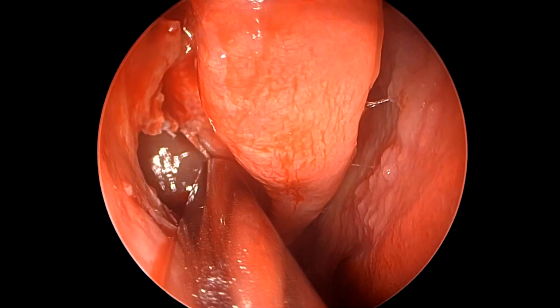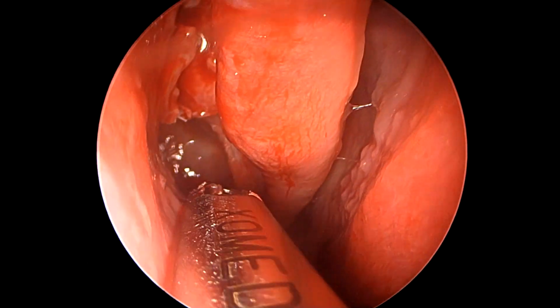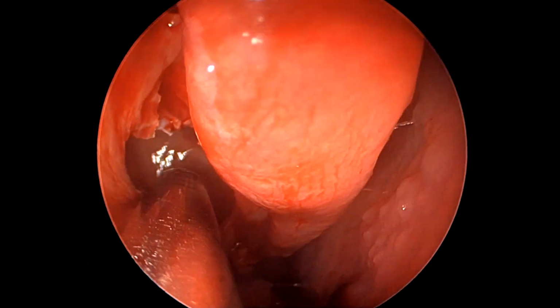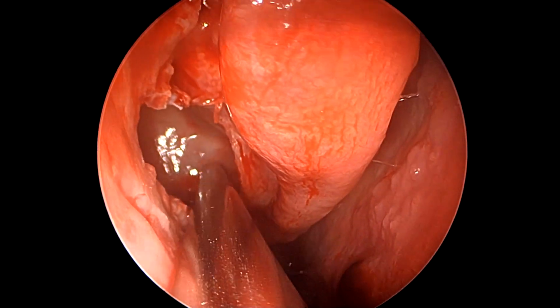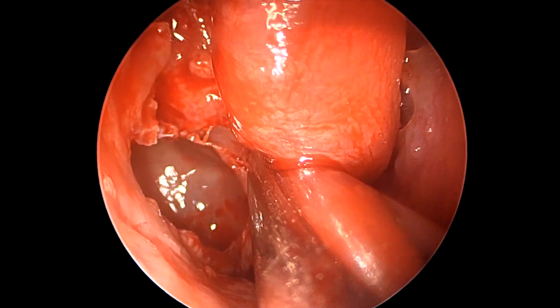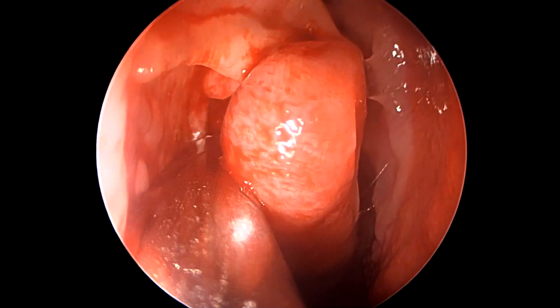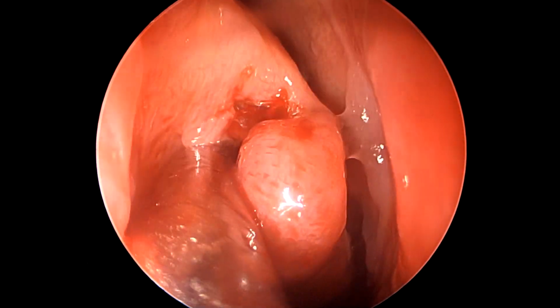As we see here, we're using the microdebrider blade, a straight blade for now, to increase the maxillary antrostomy. Care is being taken to increase it inferiorly, slightly posteriorly. We do not have any superior lever because of the orbit. And posteriorly, one must not make it flush with the posterior wall because that leads to potential trauma to the sphenopalatine artery.